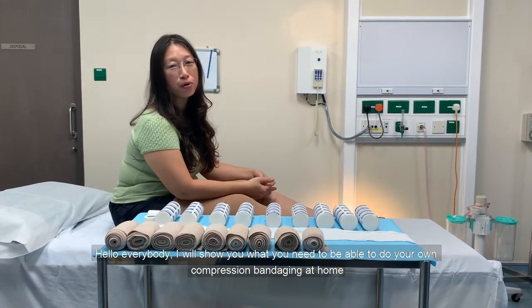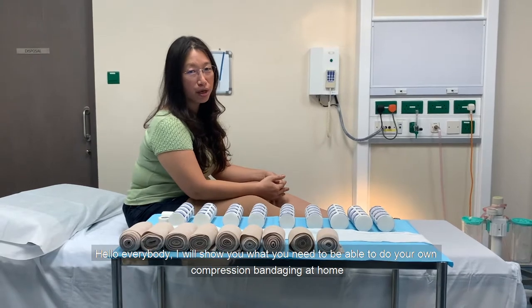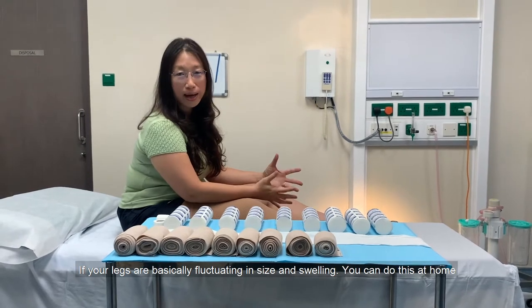Hello everybody! I will show you what you'll need to be able to do your own compression bandaging at home. When your legs are basically fluctuating in size and swelling, you can do this at home.